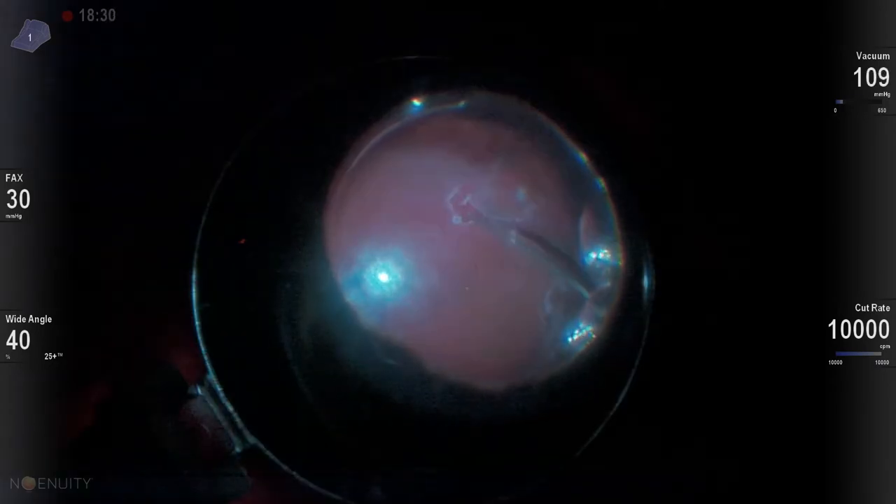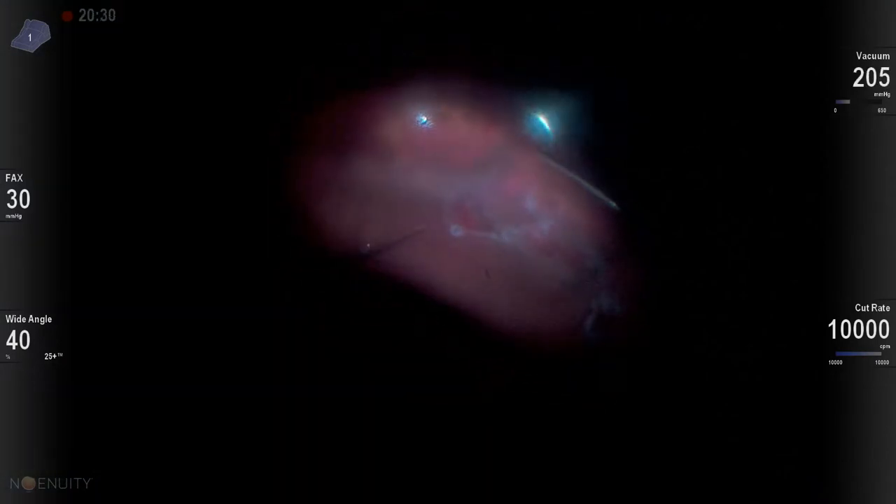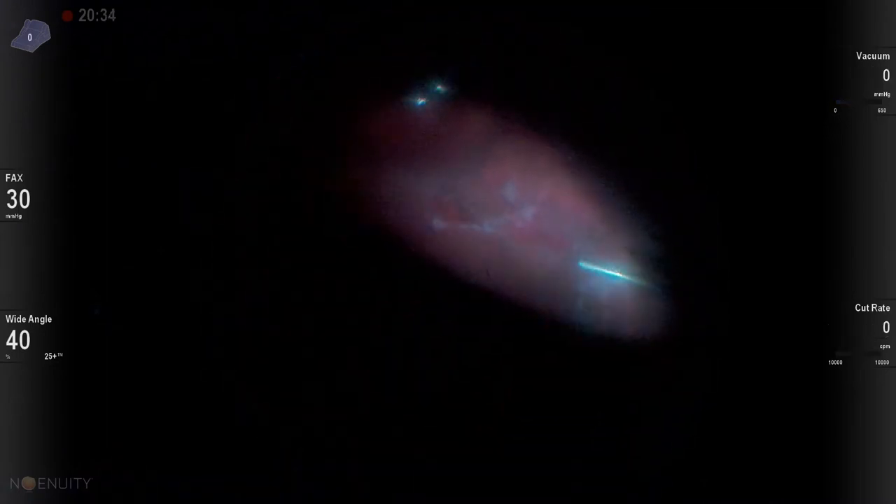It's really critical to get support on that anterior aspect because that's where the vitreous is going to contract and pull up from. Posteriorly, there shouldn't be any vitreous traction, so you can let that fall on the downslope or off of your buckle.